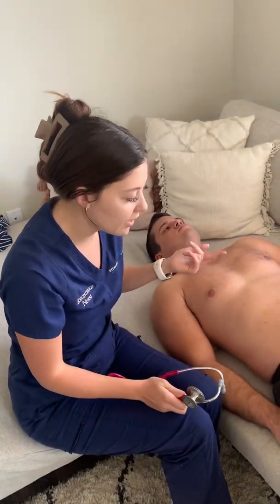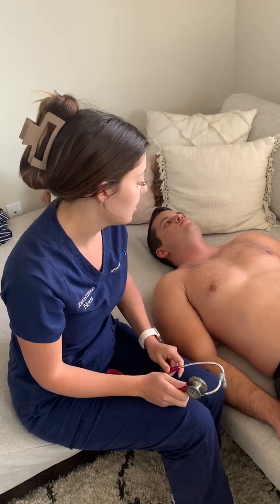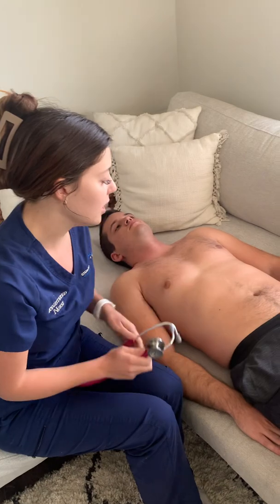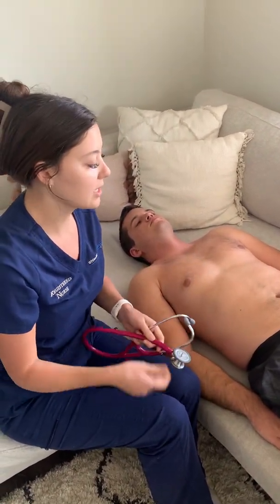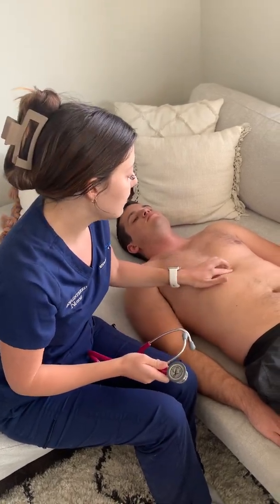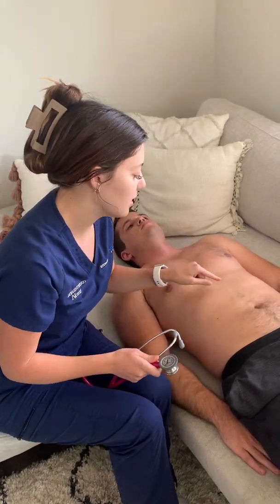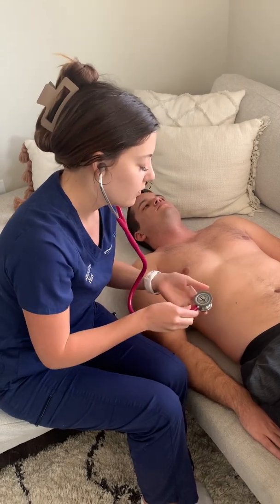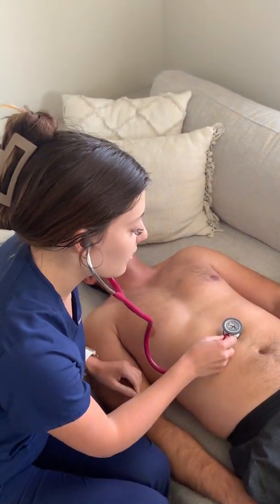If I did not hear any bowel sounds, I would have to listen for at least 5 minutes to confirm that finding. Next, I'll listen for bruits, first in the abdominal aorta. So I'm gonna listen with the bell of my stethoscope because it picks up our lower pitched sounds. So I'll listen between the xiphoid process and his umbilicus. I can actually see a little pulse from his abdominal aorta, so I'll listen for any bruits here. And I don't hear any.